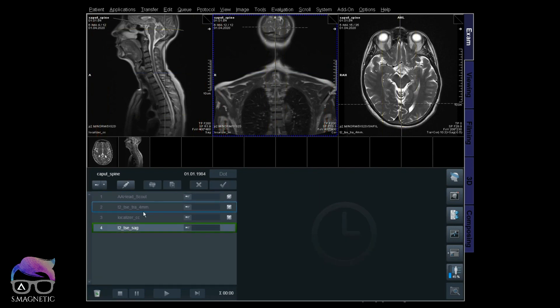For the head you should use either fix or reference, because you don't want to use ISO due to the small table movements and re-shimming. Let's pull down the T2 and demonstrate. We know this T2 was positioned for the head using fixed position mode - let's see what happens now.